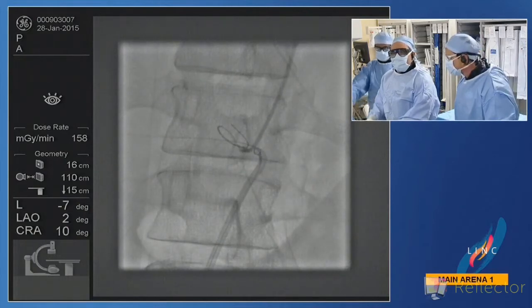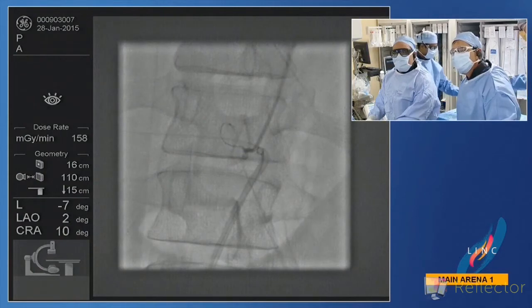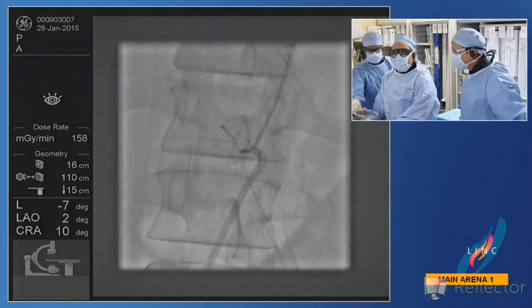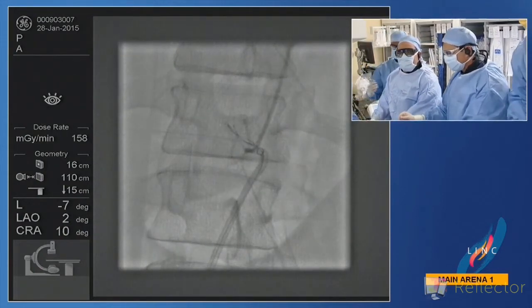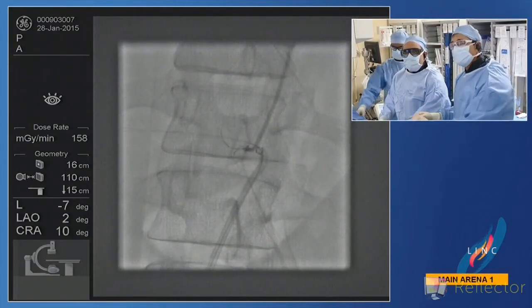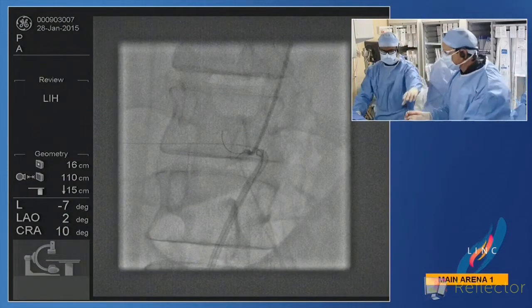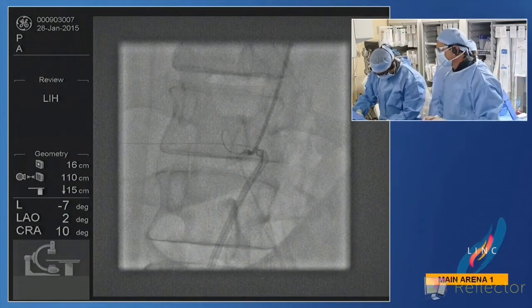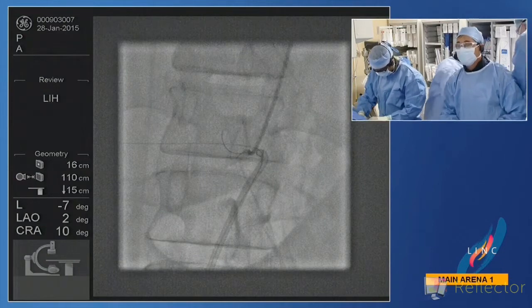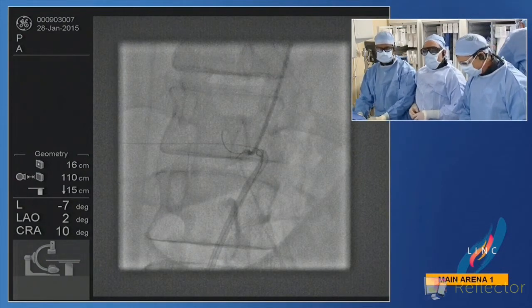So you can't just get a regular glide wire? It's hard to get a wire out through all that tortuosity. I think that we're going to get a regular glide wire here. I think this is going to work pretty well. All right, so as you're working there, what is your wire going to be that you're going to put your Viabahn over? Is it an 018 wire or is it an 035? We already have an 018 Platinum Plus out there. I already made that exchange.